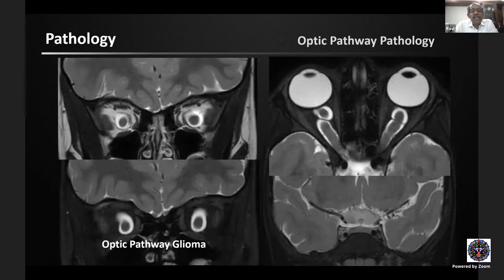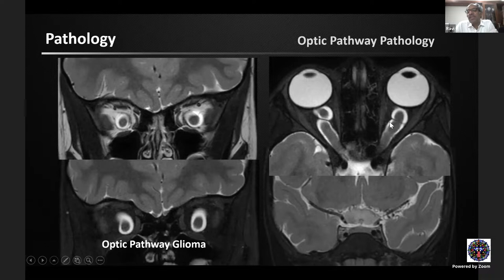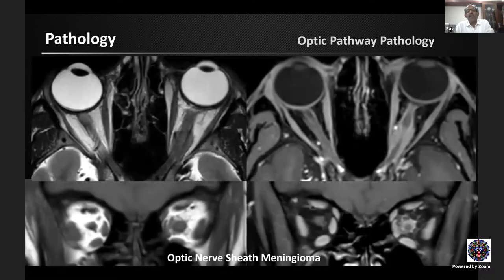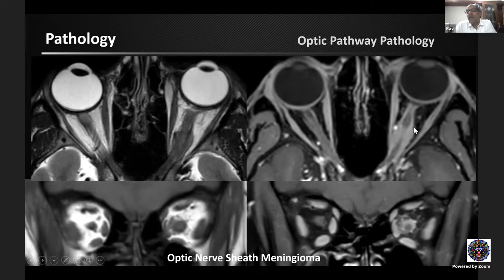For neoplastic optic pathway pathology, optic nerve glioma shows fusiform enlargement extending to the optic chiasm with perioptic nerve sheath dilatation — extent of chiasmal and brain parenchymal involvement, not visible on CT, is clearly demonstrated on MRI. Optic nerve sheath meningioma shows the classic 'tram-track' sign on axial images — enhancement along the walls of the optic nerve with the nerve itself not enhancing — or a 'donut' pattern on post-contrast coronal images.